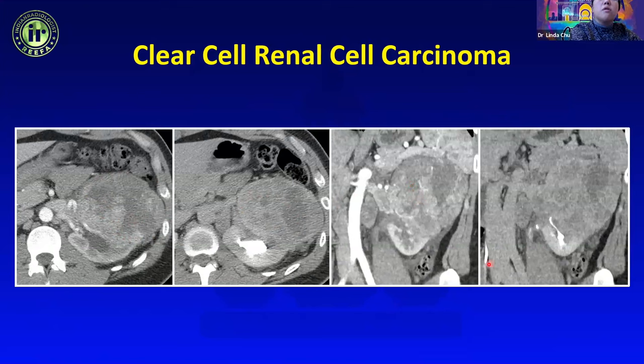An adrenal myelolipoma can be quite large and it may be hard to tell the precise organ of origin — kidney versus adrenal — so it remains on the differential for fat-containing retroperitoneal masses. In another case, a very heterogeneous fat and soft tissue mass appears to wrap around the kidney without a cortical defect or claw sign, pointing more toward retroperitoneal liposarcoma.